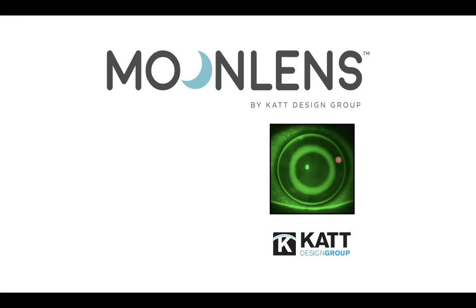If you were to make any change on the lens based off the topographical maps that you are going to take on each visit, if you do want to make a change, that change should be at the very end of the month. I wouldn't suggest you doing any changes.